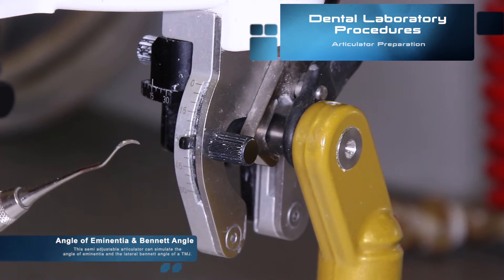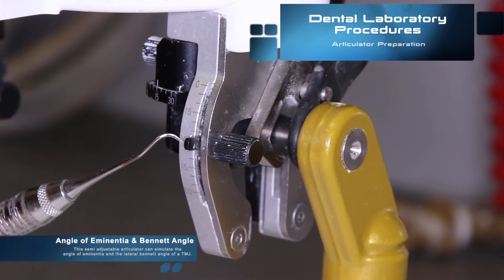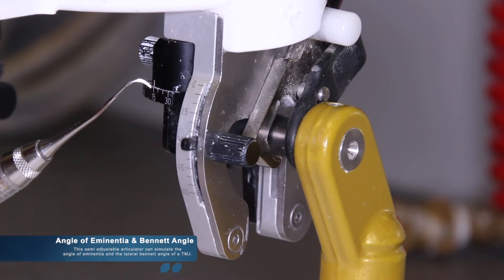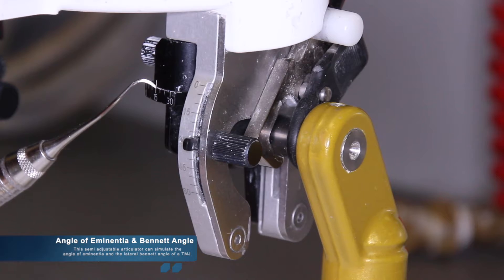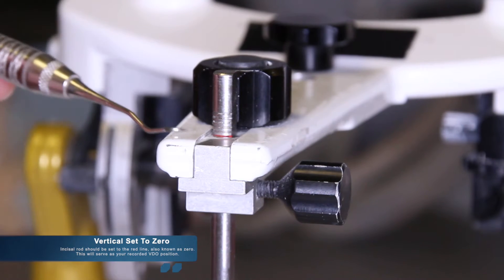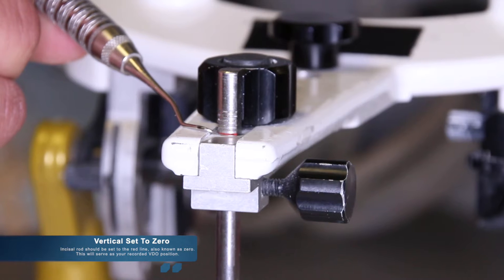Next, we should set our articulator to our average settings. The semi-adjustable articulator can simulate the angle of eminentia from 0 to 60 degrees and the lateral Bennett angle of 0 to 30 degrees. The angle of eminentia should be set to 30 while the Bennett should be set to 15. The vertical should be set to 0. The incisal rod should be set to the red line, also known as 0.